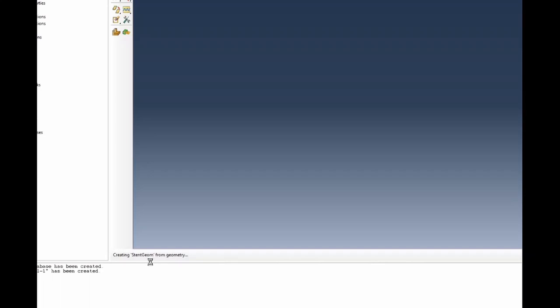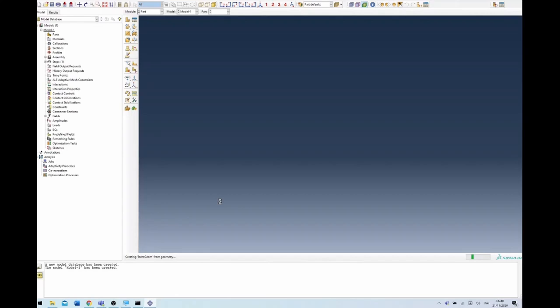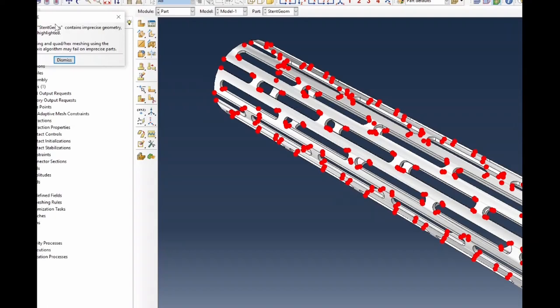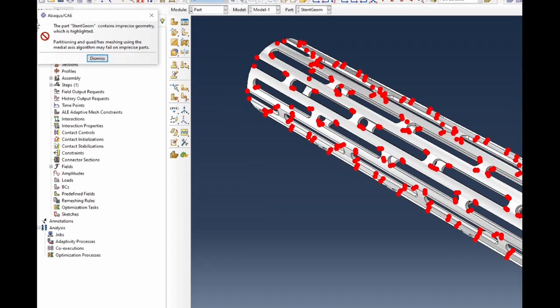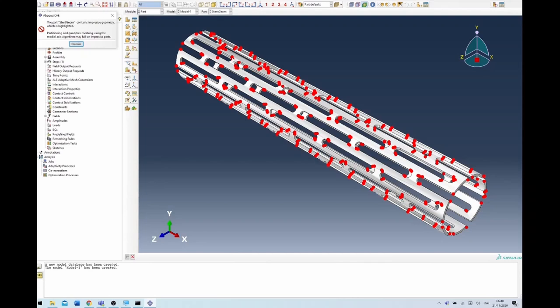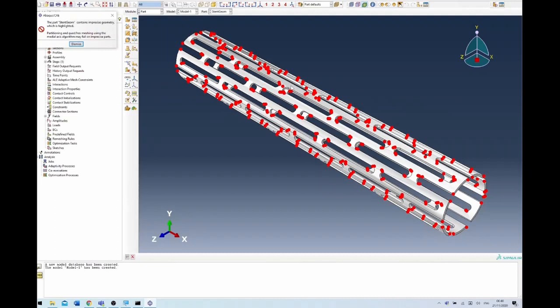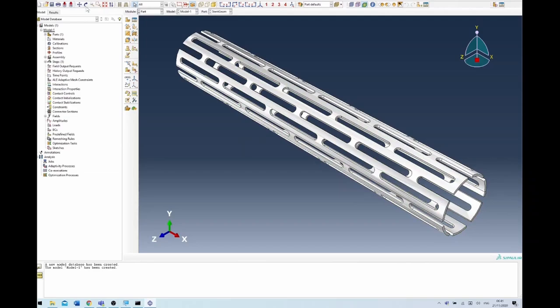It's scanning and importing the model, giving you a progress update. Once that's done it should come up on the window. Don't get alarmed when you see this - there's a warning at the top saying this part 'stent geometry' contains imprecise geometry which is highlighted. Partitioning of a quad hex mesh using the medial axis algorithm may fail on this imprecise section. This is just a warning because the software was created in SolidWorks, which has higher geometric modeling capability than Abacus, so it's picking up things that normally Abacus wouldn't worry about. We're going to leave that for now and dismiss it.